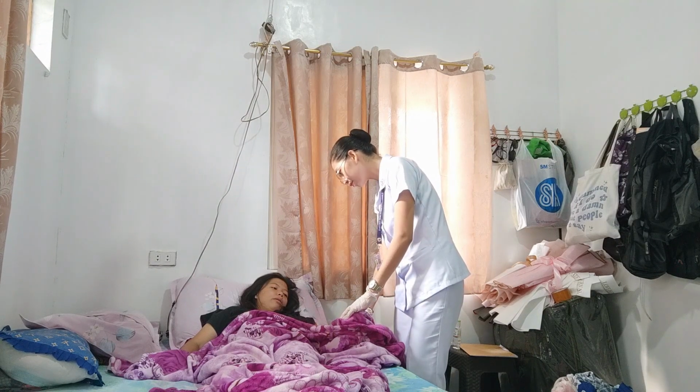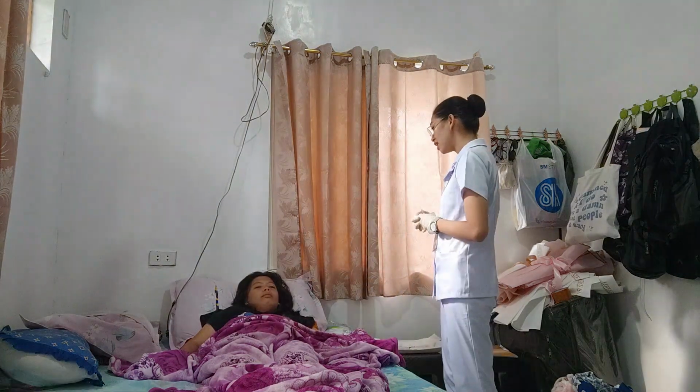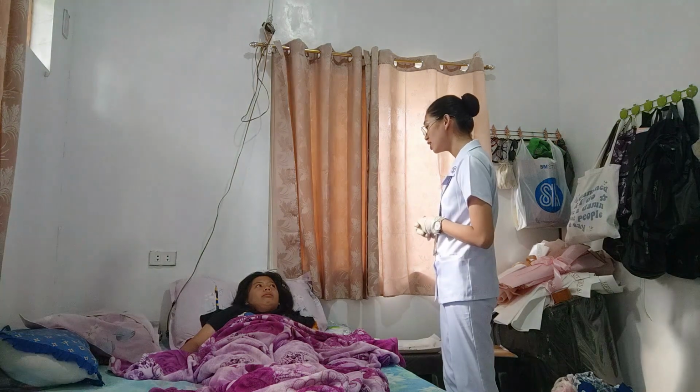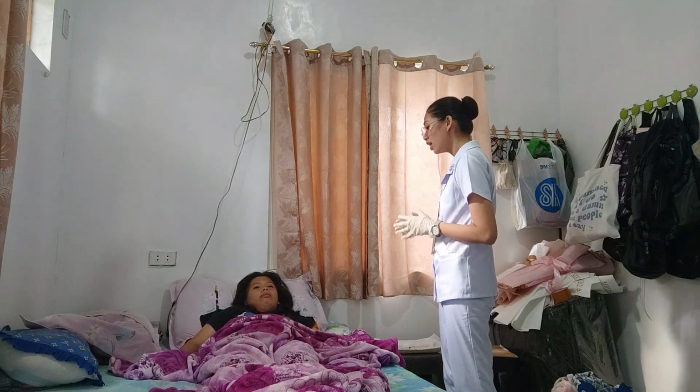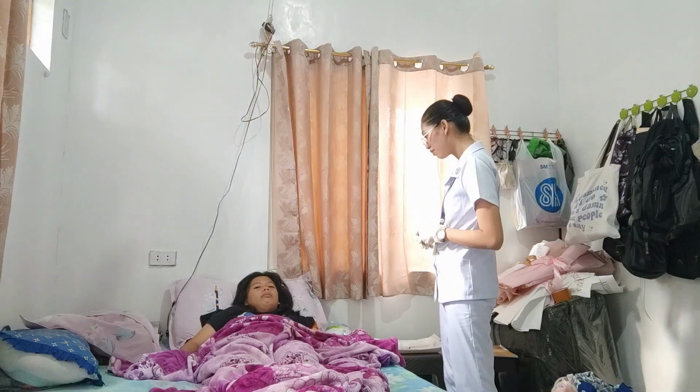March 7, 2004. Okay, thank you, ma'am. So today, ma'am, I will be injecting insulin as per requested by your attending physician, Dr. John, since you have a type 1 diabetes. So this will help you in controlling your blood sugar level. Would that be fine with you, ma'am?